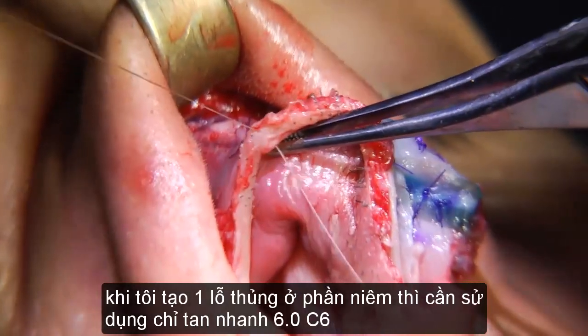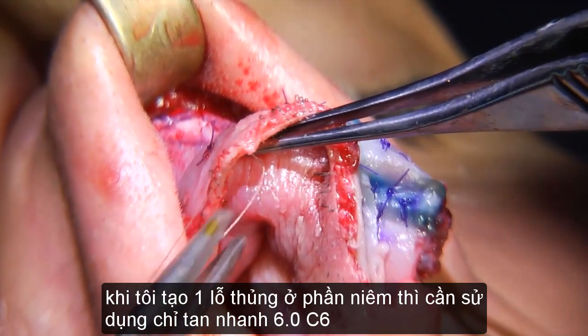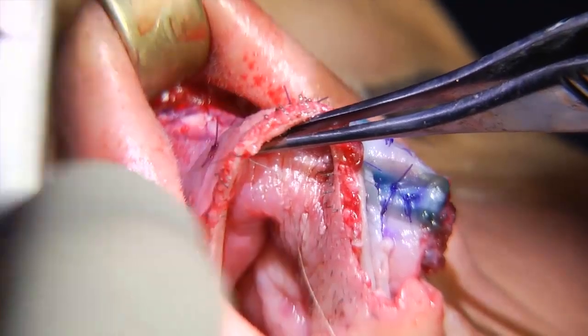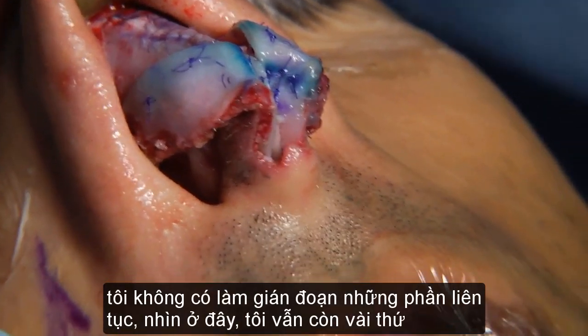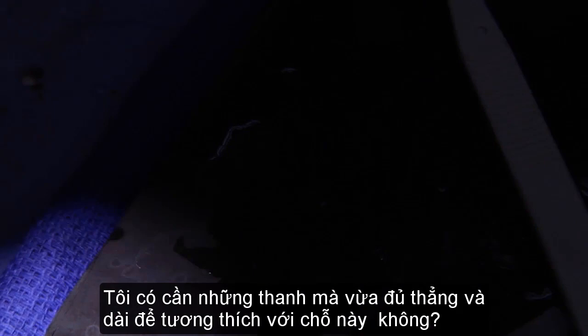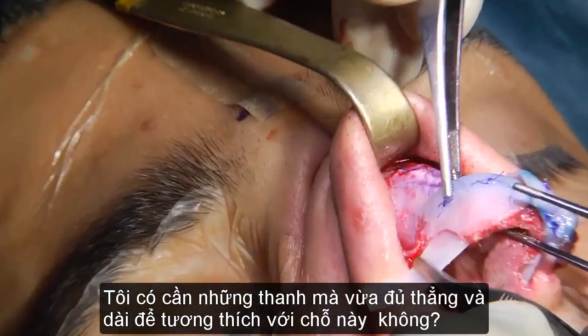This is 6-0. When I make a hole in the mucosa, it's 6-0 rapid. I didn't really interrupt all the continuity here. You see, I still have something. Do I have something which is straight enough and long enough to act appropriately here?